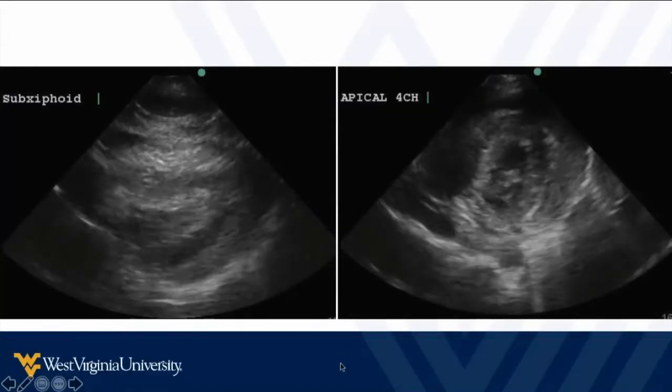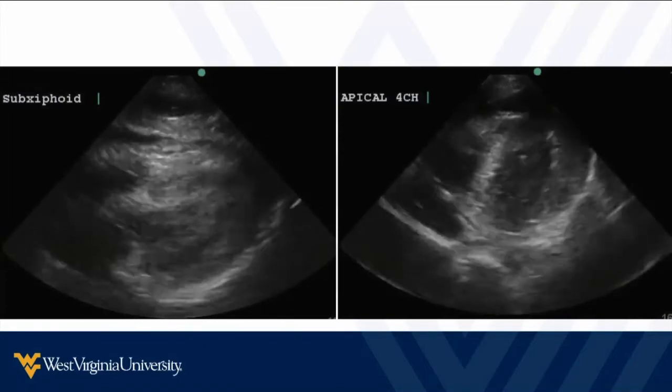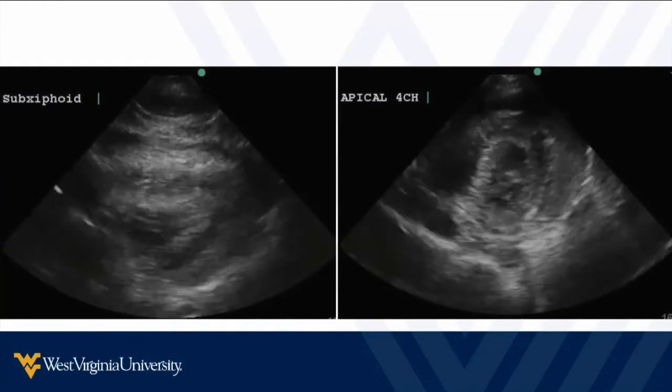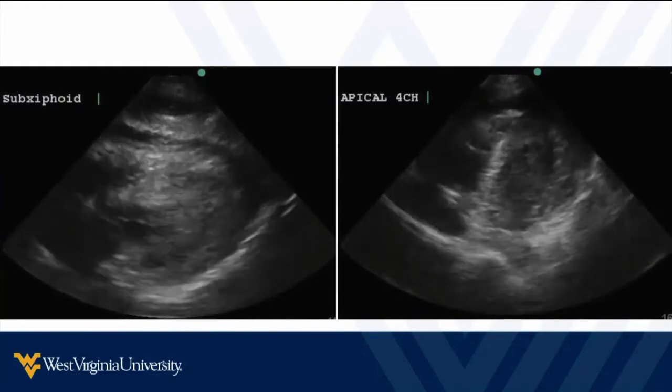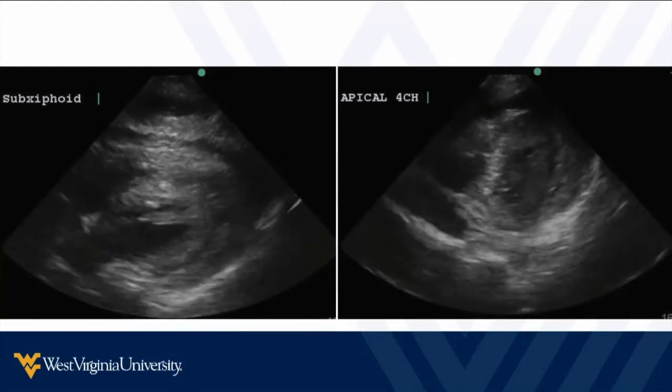These can be difficult, and especially difficult because, depending on your work setting or your clinical environment, trauma to the heart may not be that common, so you may not see it a lot to recognize the differences in these subtle cases, but it's critically important in some of these patients.